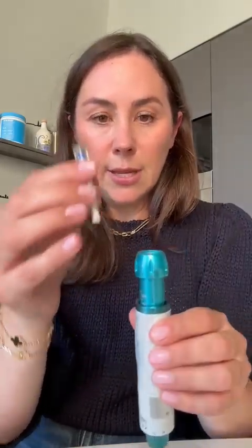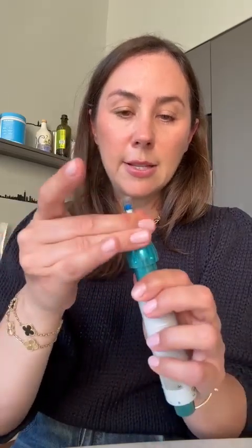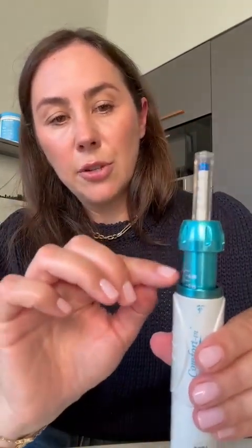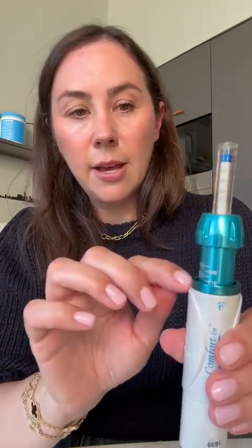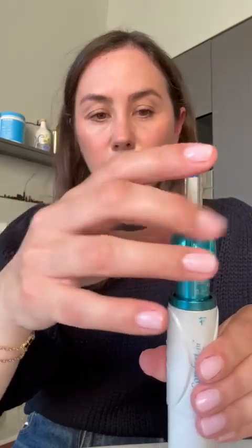Next I screw the syringe into the top of this piece and it just screws in nicely like that. Then it's ready to go. One last thing I always do is make sure there's enough room between the top of the Comfort-In piece and this area — that just prevents insulin from squirting through the nozzle. You can just turn this left or right to adjust that. And that's it.